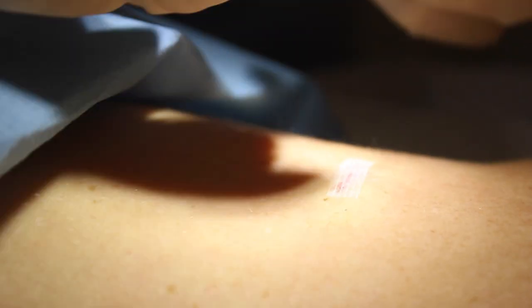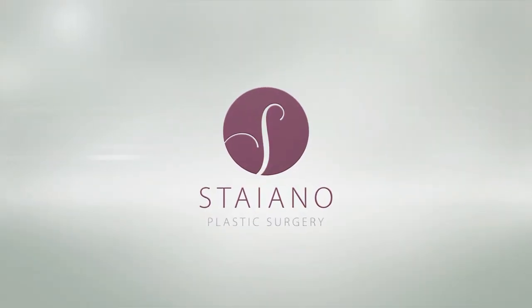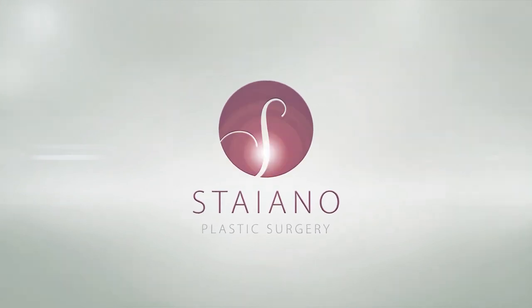These are called Steri-Strips. You usually just put three Steri-Strips over the wound, followed by a waterproof dressing, which means you can wash and shower normally.